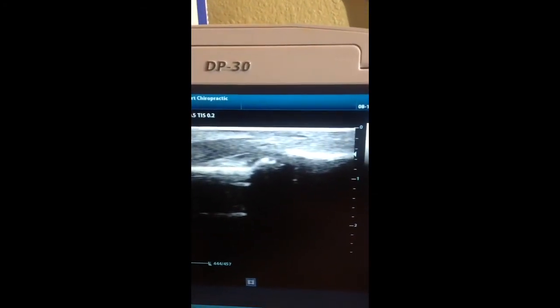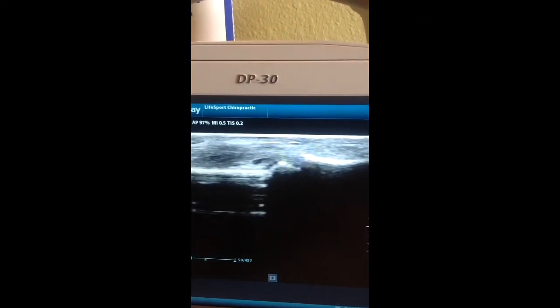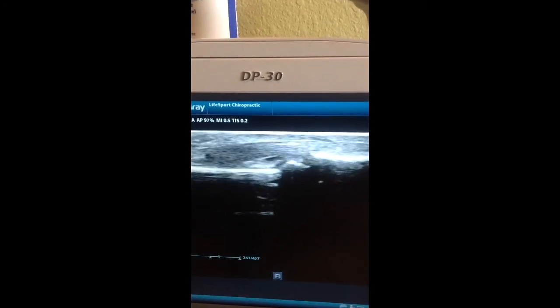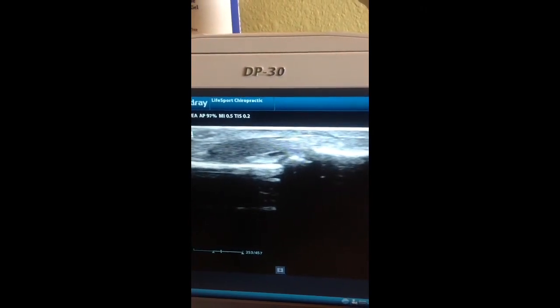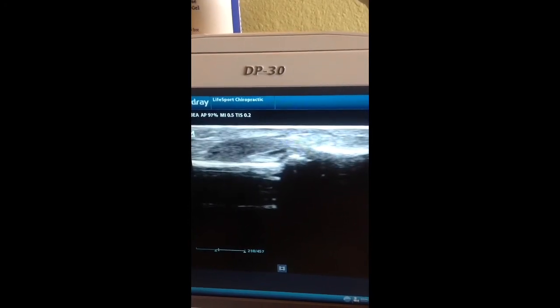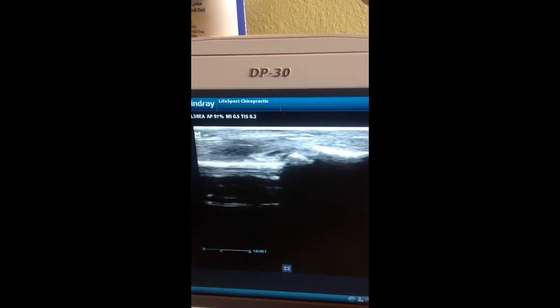We can also evaluate — which is one of my favorite things — we can actually glide those muscles. You can see that tendon gliding. I'm wiggling my finger back and forth in this view, and that tendon is gliding in one direction and then the other. We look to see if there is scar tissue that adheres these two together.